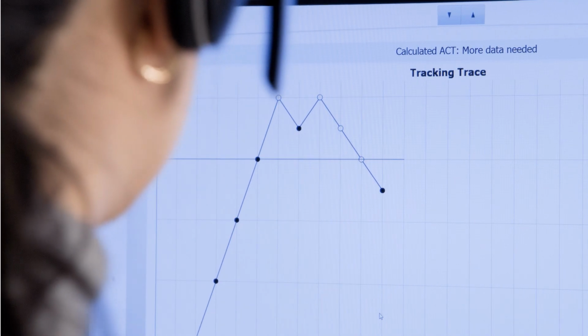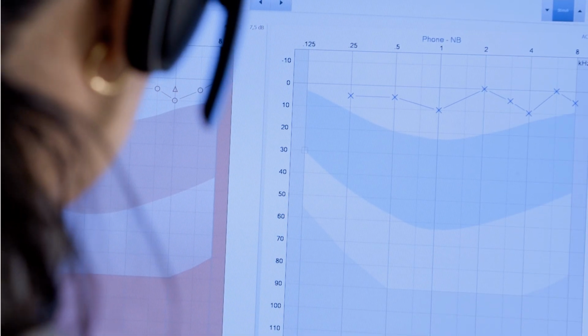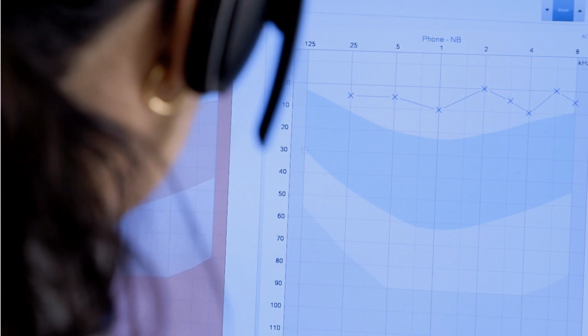The Audible Contrast Threshold Test, also known as ACT, allows you to assess how well someone can hear in background noise. It does this by using a special signal that is non-language specific. ACT makes full use of the pure tone audiogram, making this an above-threshold test.